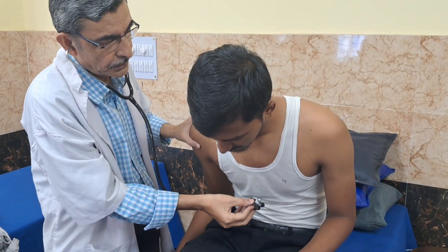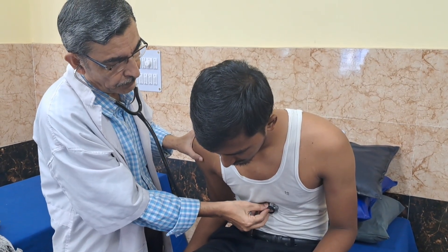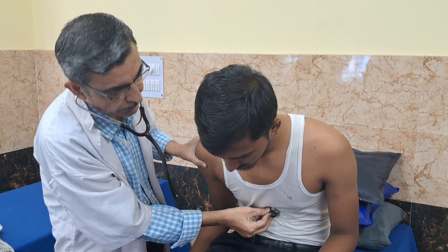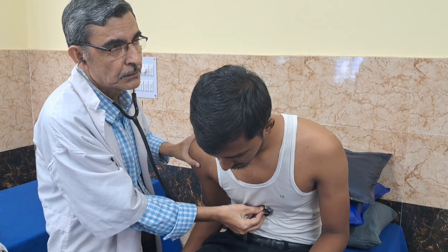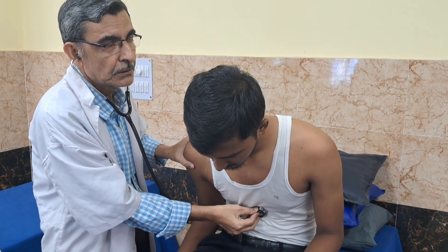Sit the subject forward and auscultate with the diaphragm at the tricuspid area with held expiration.